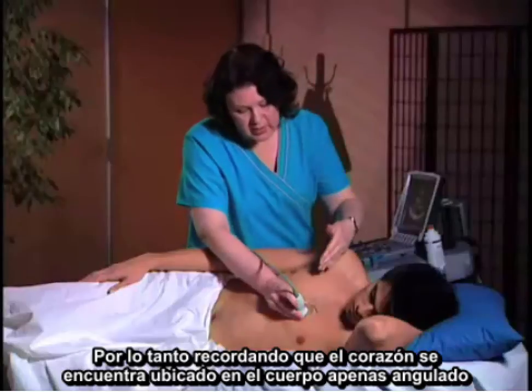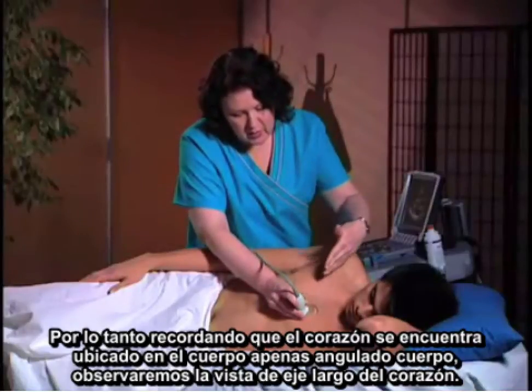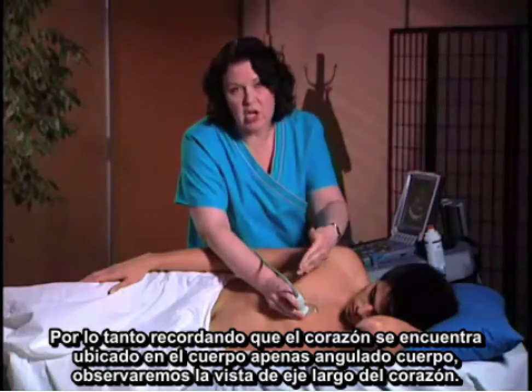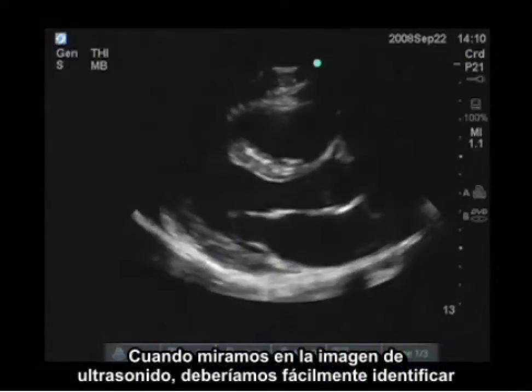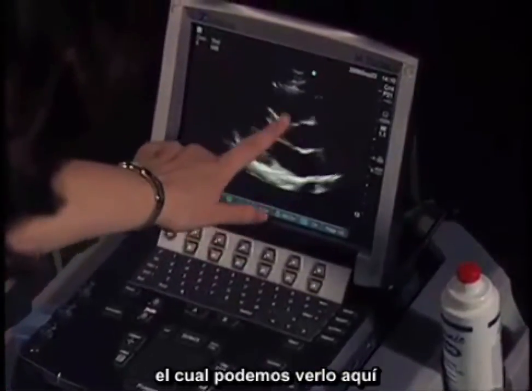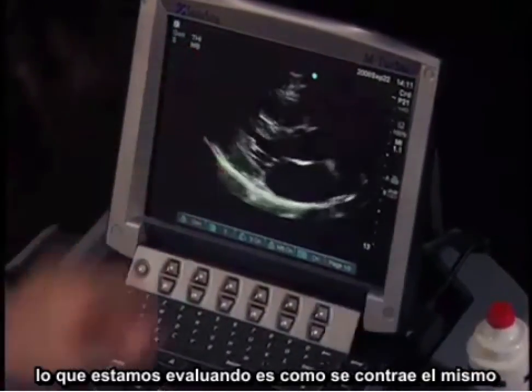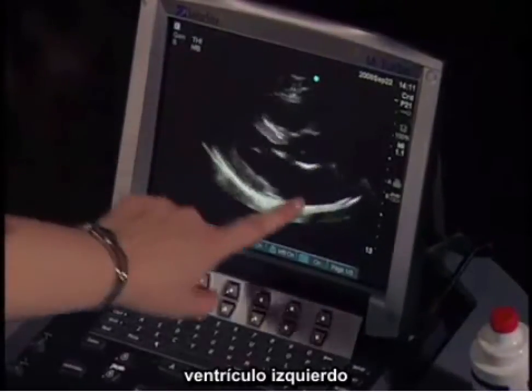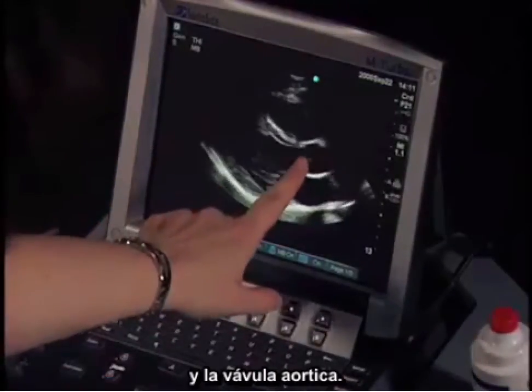Remembering that the heart sits in the body at a slight angle, this is going to be the long axis view of the heart itself — not the long axis of the body, but the long axis of the heart. When we look at the ultrasound image, we should quickly be able to identify the left ventricle, and what we're evaluating for is the squeeze of this left ventricle. On this image, we have the right ventricle, left ventricle, left atrium, the aorta, mitral valve, and aortic valve.